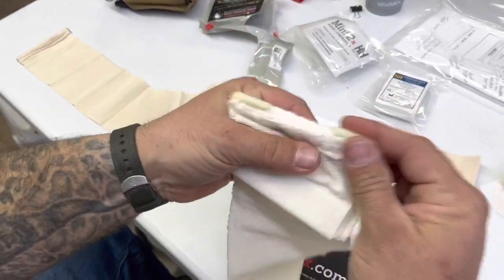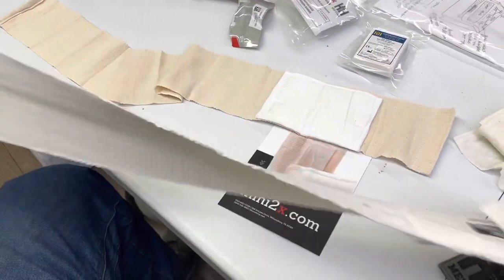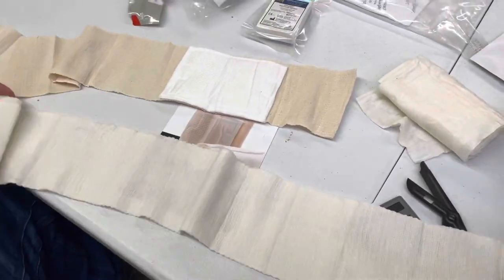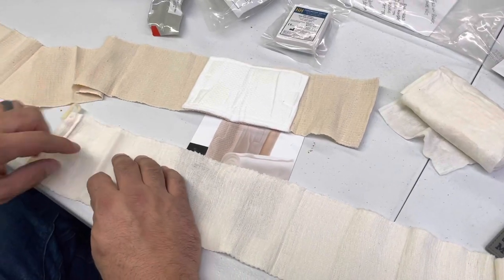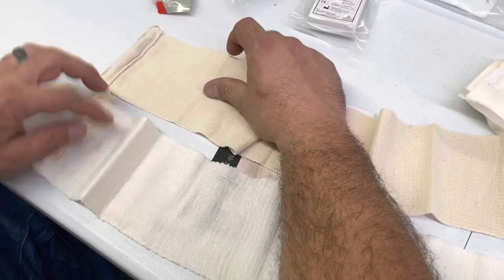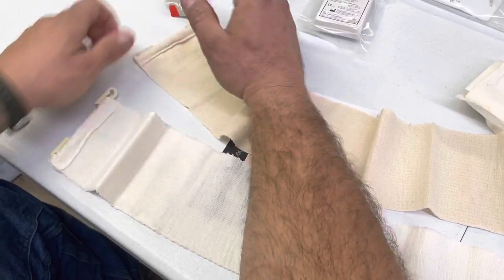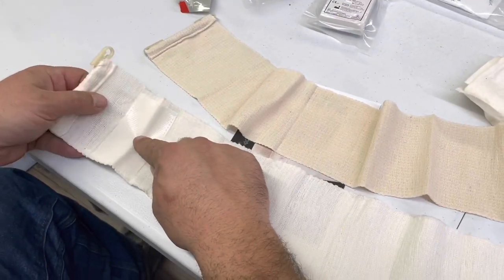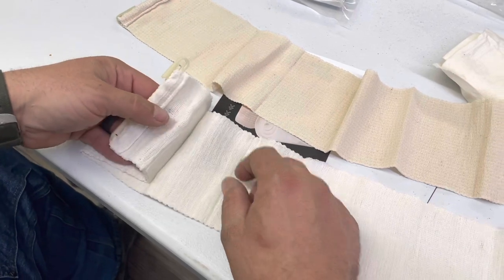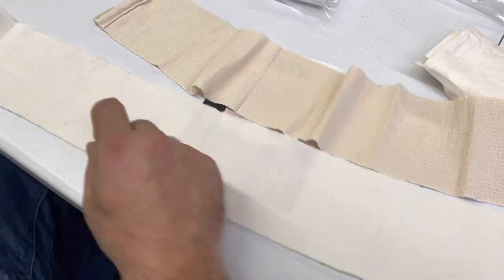After you get this on somebody, you can fold the loop down and press it, which means you can use two hands to secure the C-clips rather than fighting with one hand. That's why we use North American Rescue bandages in our kits - predominantly because of this hook and loop. The H&H doesn't have that, so you're fighting to keep it from coming off. With the NAR you just fold it over and it's stuck, then take your time with the C-clips.